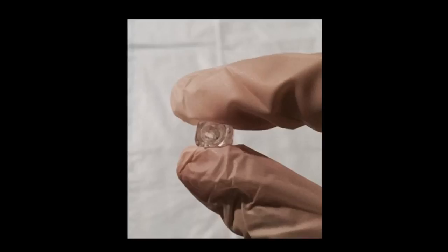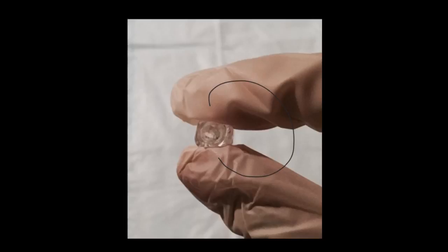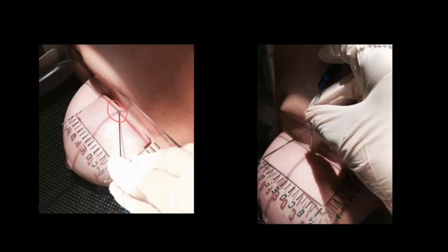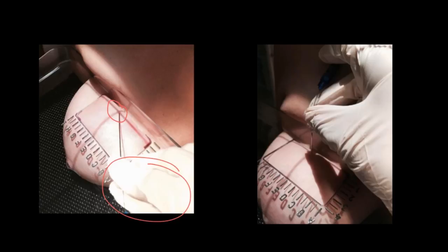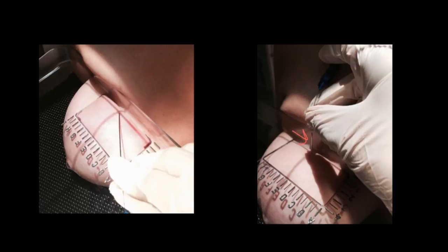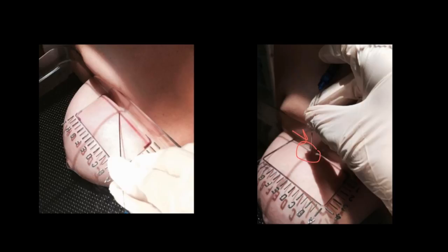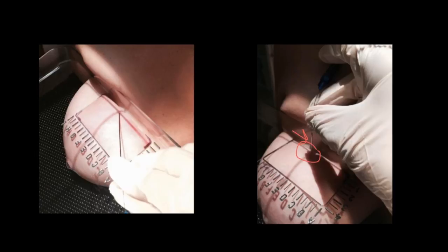Regarding technique, there are a few methods that facilitate needle localization. When holding the hub, your fingers should grip each side so the square hub is seen centrally with your hand off to the side — this allows you to see the shadow of the hub, which guides needle advancement. Place the tip of the needle at the intersection of the crosshairs at an angle, then bring the needle perpendicular to the skin surface so the center of the needle is in the center of the square hub shadow. The needle should remain centered in the hub shadow at all times. Advance the needle one centimeter past the target distance as measured on pre-localization images, or advance the hub to the skin surface if breast compression is less than that distance.